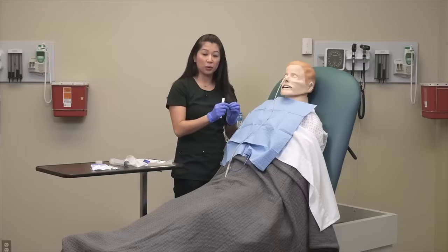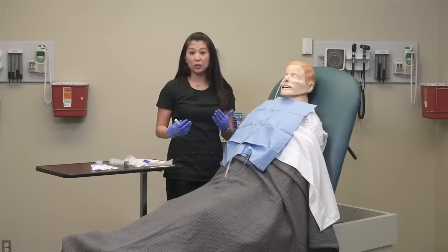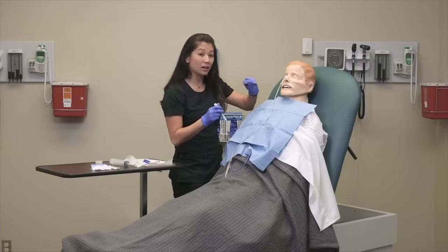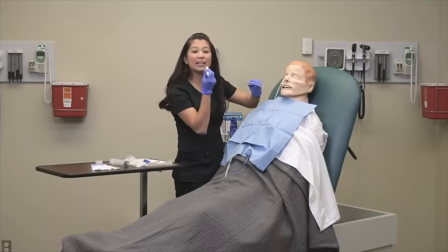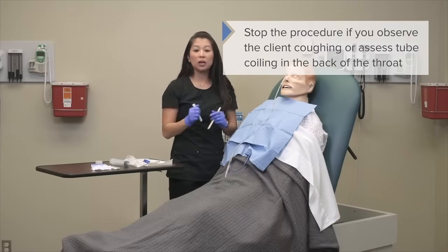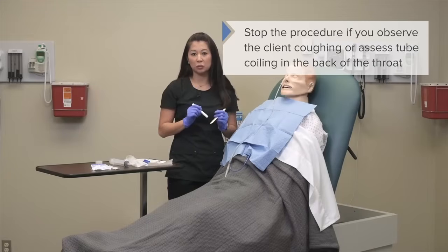Clearly this guy went pretty smooth, but as I'm advancing, if you have a helper with you, it's a great time to have your helper. As soon as I went past the nostril, I'd like to take a tongue depressor, push down the patient's tongue, and pen light in my patient's mouth. So as soon as we go past the naris and past the back of the throat, we can assess and make sure that the tube is not coiling in the back of the patient's throat.